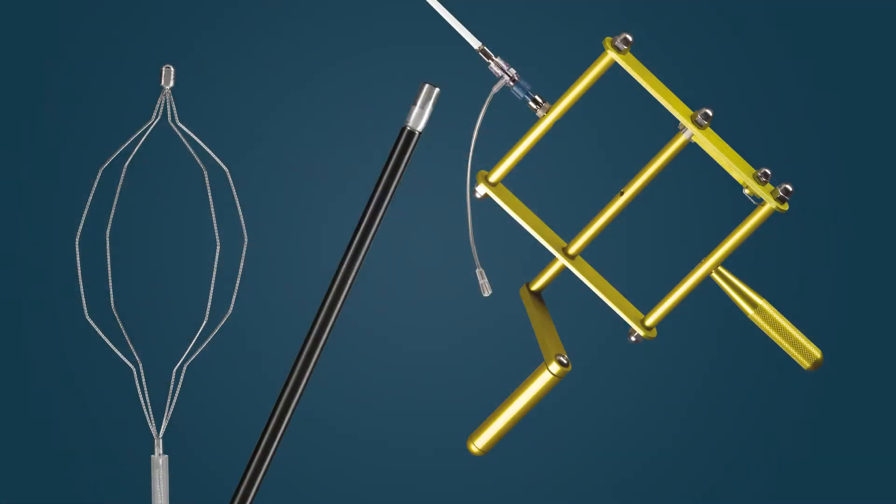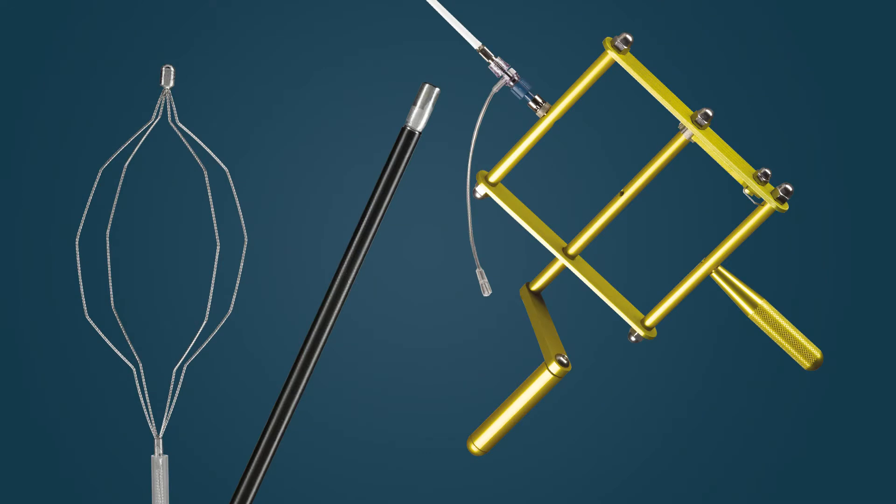When I choose to do extraction with a basket, we pick the basket depending on the duct size — there are a variety of sizes available. I tend to prefer a basket that is compatible with a Sohendra lithotripter. Just in case a basket gets stuck, I'll be able to use my rescue lithotripter to break up the stone. So I double check, and I have my assistant check, that the basket is compatible with that device.